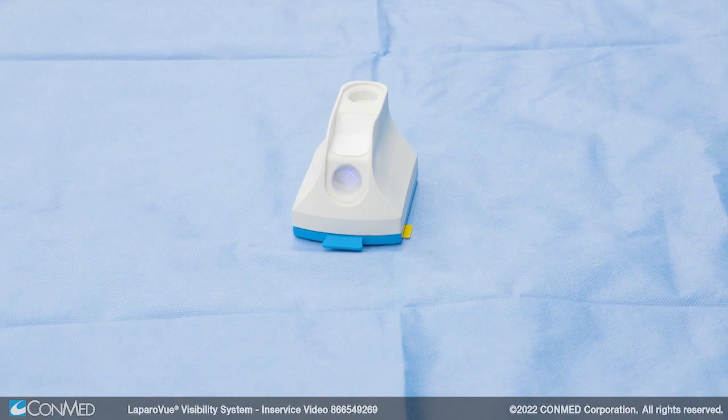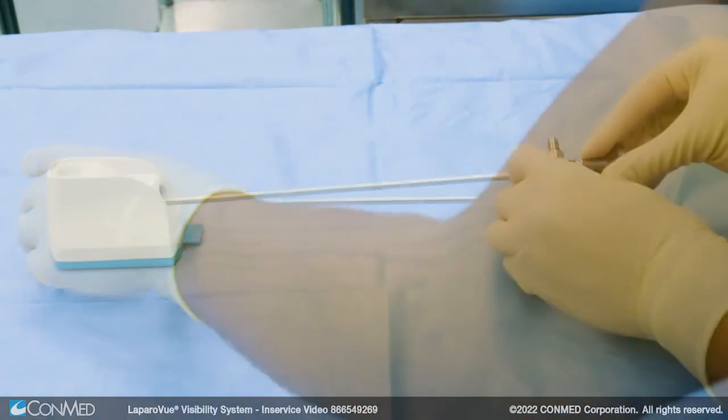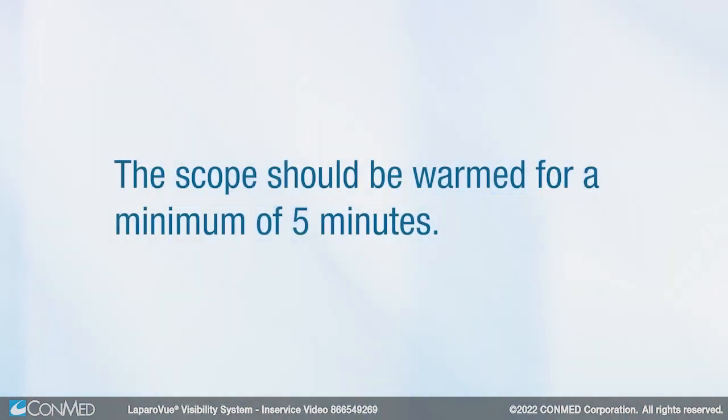Now the device is ready for use on a flat, stable surface. Place the scope in the horizontal port to warm the scope. Use the scope cradle to support the scope and prevent it from rolling off the table. The scope should be warmed for a minimum of five minutes.